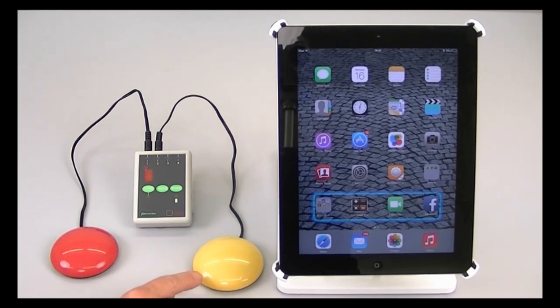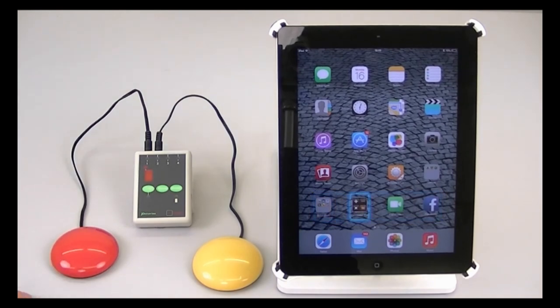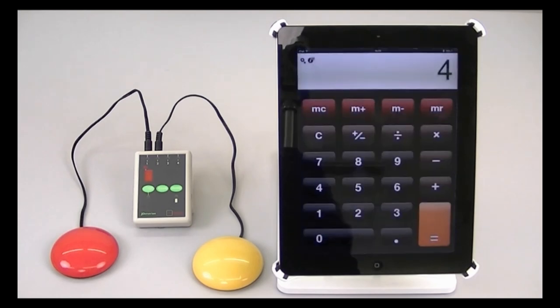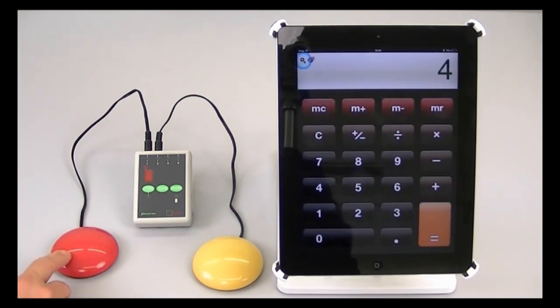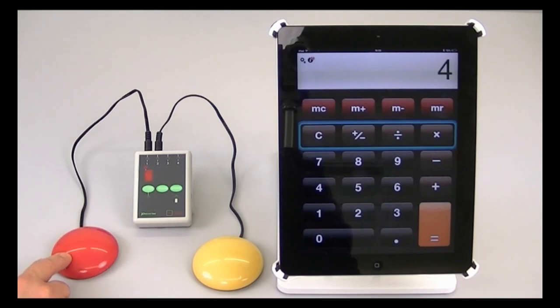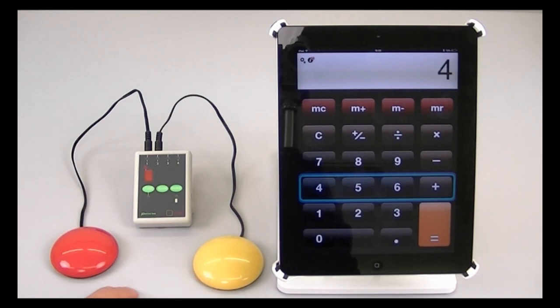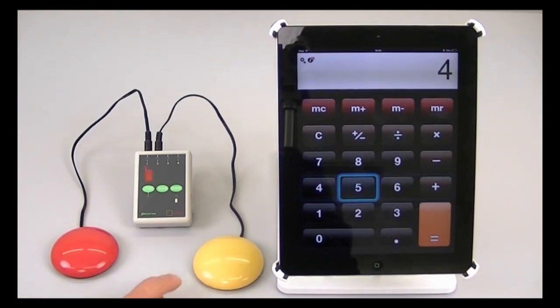And if I'm going to use the same example as in the previous video, let's go for calculator. So I'm going to select that row, then scan to calculator, open that app, and for example, if I want to enter the number 5, select that row, scan to the number 5, select, and now I'll have a number 5.